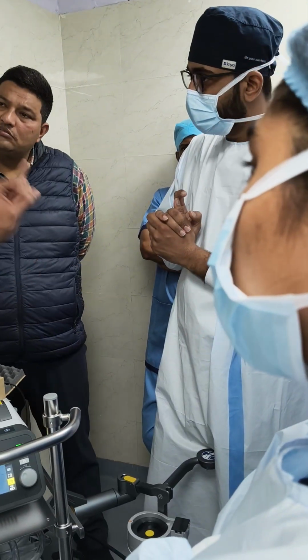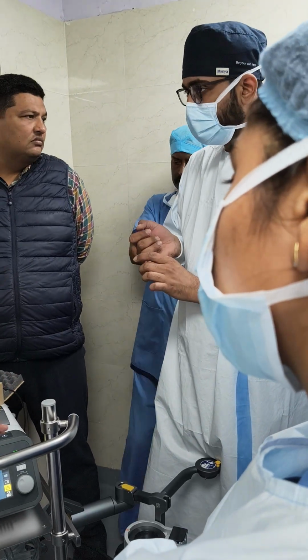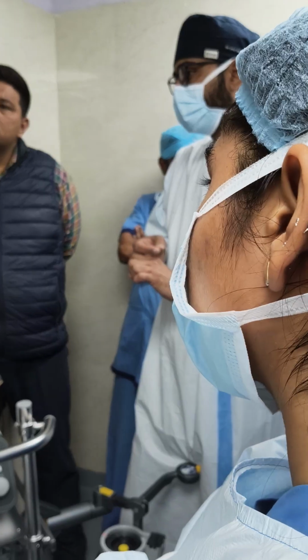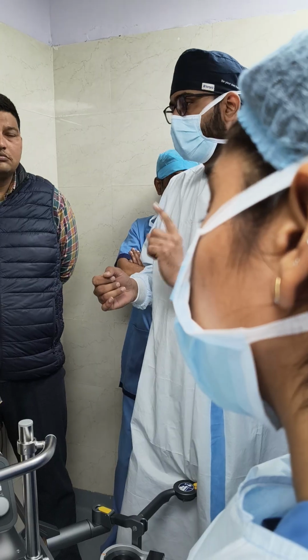The interventions, I will tell you: zero flow, arterial flow, venous bubble. Bubble. These are the interventions. And backflow also. So these are the four interventions, three interventions and four sensors. As soon as, suppose, there is an arterial bubble, it will stop the pump first. That is the first intervention.